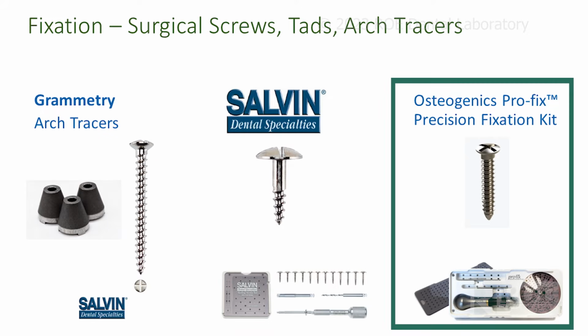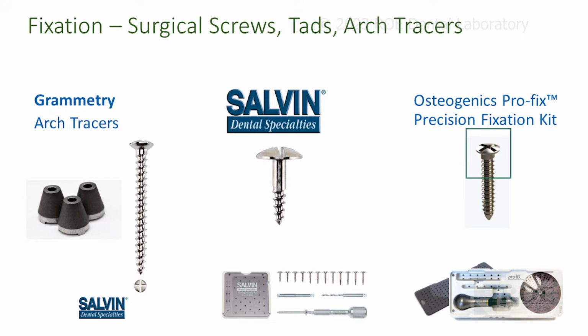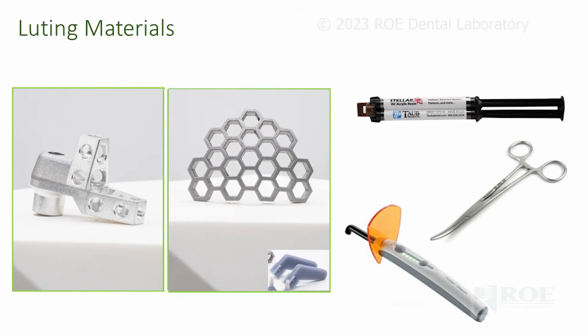Or if you already have the Osteogenics Pro kit, the ProFix kit, you can use this as well. So that's the screw head that we use. And we'll also have a little spacer a little bit later in the program that you can place under these that keep them elevated above the tissue and help with scanning. All right, so you have to have some screws if you're going to use that modality.